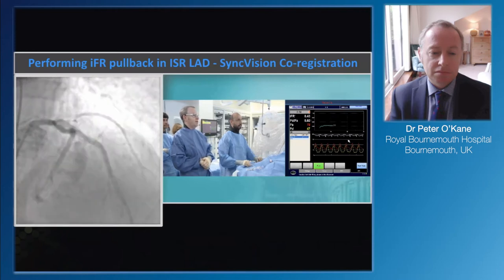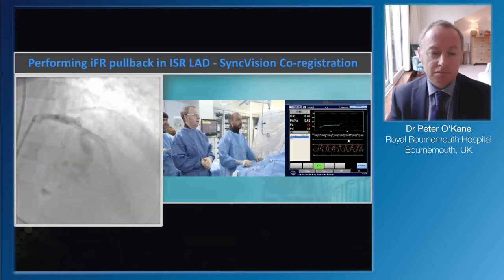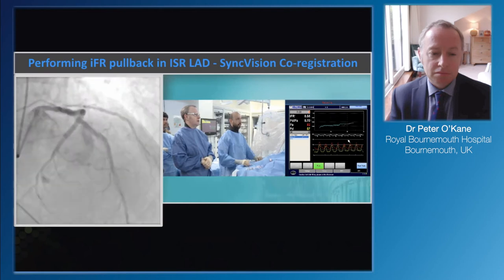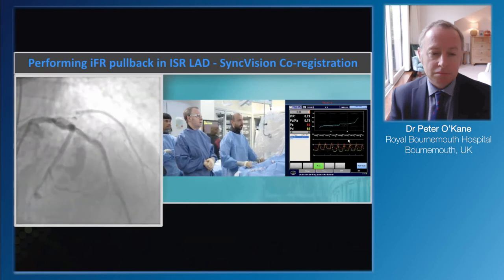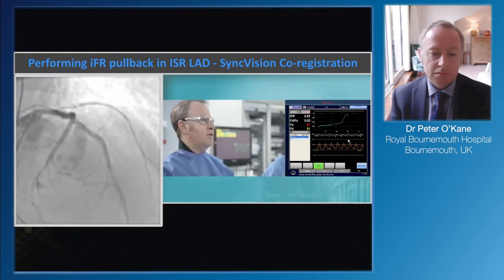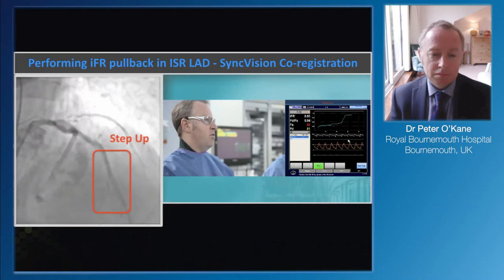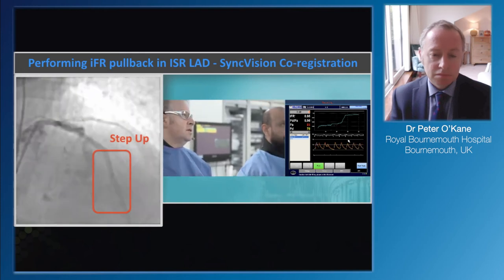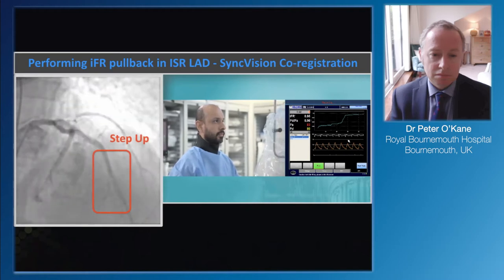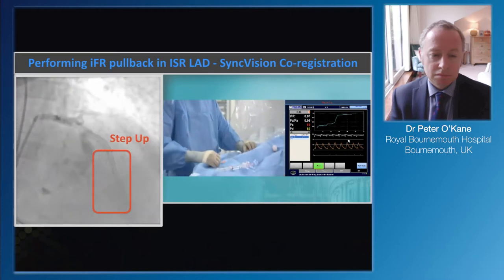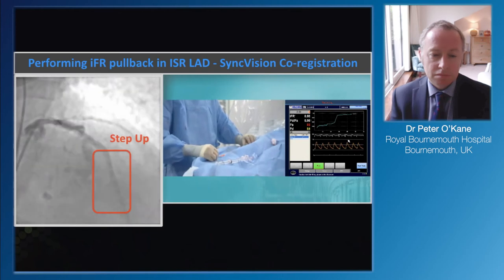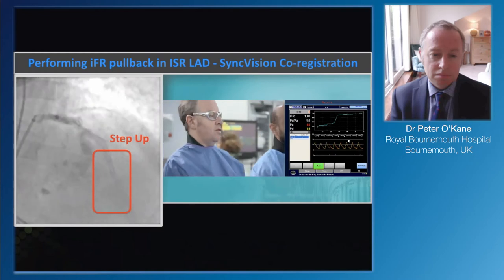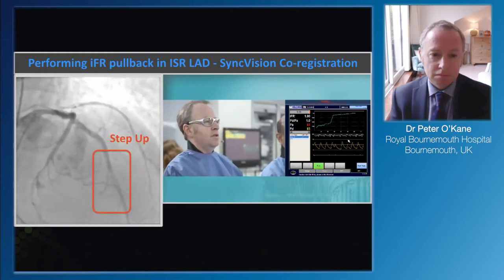We changed the fluoroscopy to 15 frames per second, which is necessary for the system to pick up the pullback of the wire. You see it jumping up - a big jump, which is actually a little bit more proximal to the stenosis, probably right on that severe lesion. There's no significant gradient more proximally. Coming back to the proximal vessel - we do a drift check and it's exactly one, so we're very happy with that.